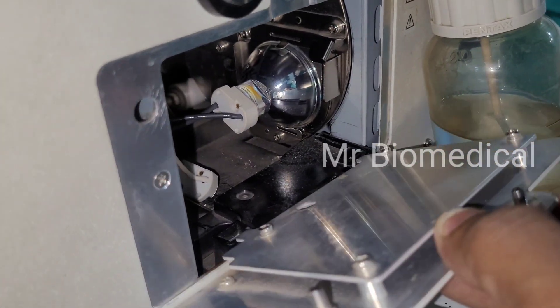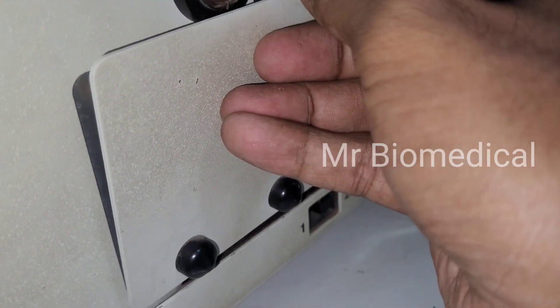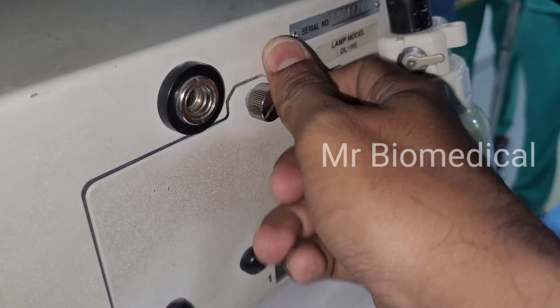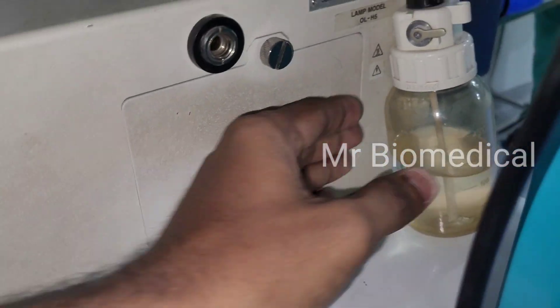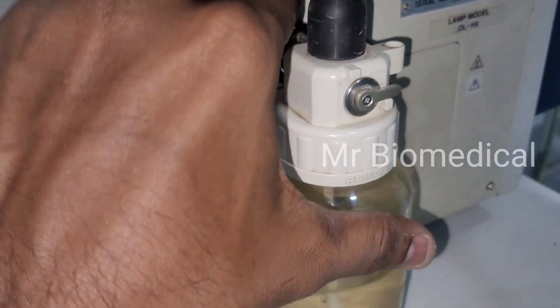After changing the bulb, we should close the door. Now let's check whether it will work or not, and put back the ejector bottle.